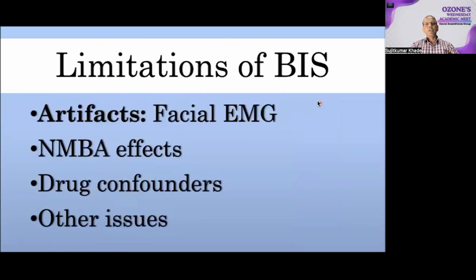There are limitations of these artifacts. Facial EMG, like if the patient is shivering, adds high frequency noise and falsely causes a rise in the BIS value. Even electrocautery or ECG signals can corrupt readings. Proper electrode placement and filtering are very important. Neuromuscular blocking agents paralyzing patients remove EMG, which can paradoxically cause BIS to read very low, even if the patient is light. One must be cautious. A BIS of 40 in a paralyzed patient might still indicate adequate anesthesia, but false lows do occur.